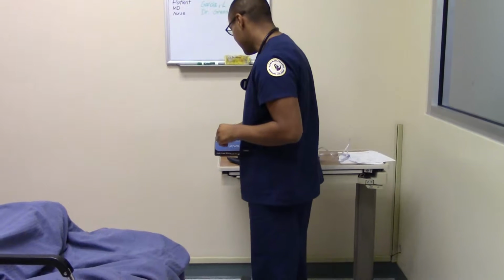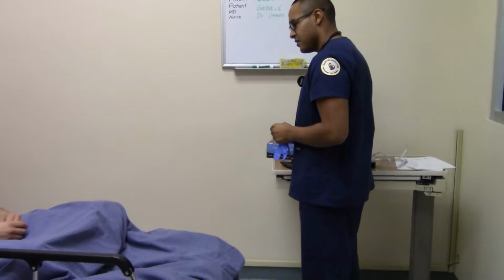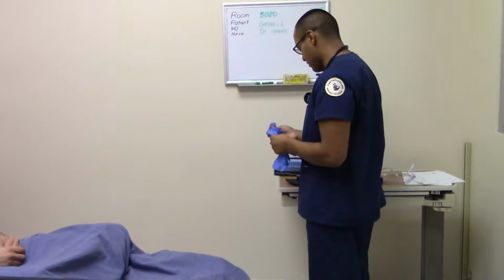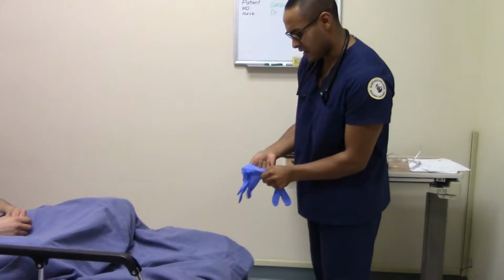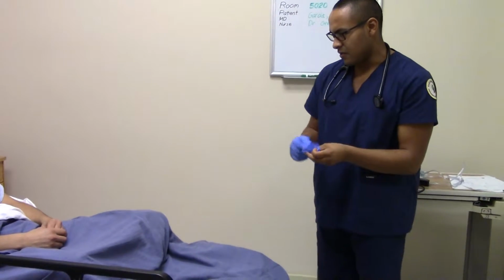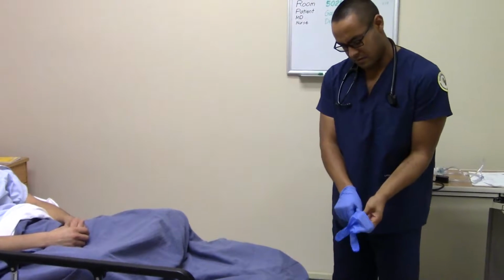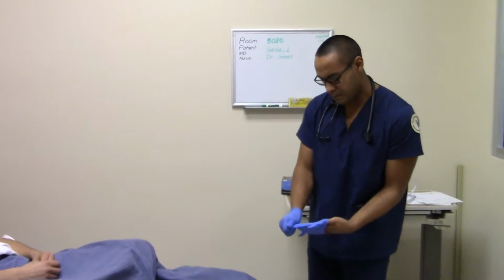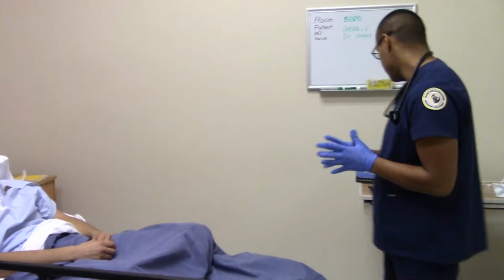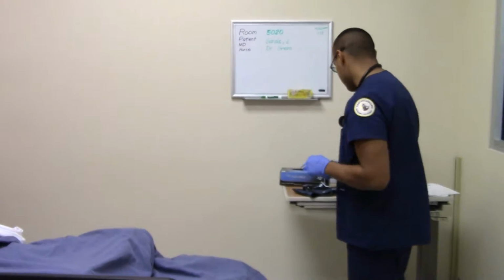All right, so how's your breathing? Yeah, it's alright. Little hard to breathe right now. Okay. Do you feel like any mucus buildup or anything like that? Nah, I don't know about that. I just feel like I can't breathe sometimes. Been coughing, but no mucus. Okay, that's fine. Hopefully after this you have wider airways, okay?